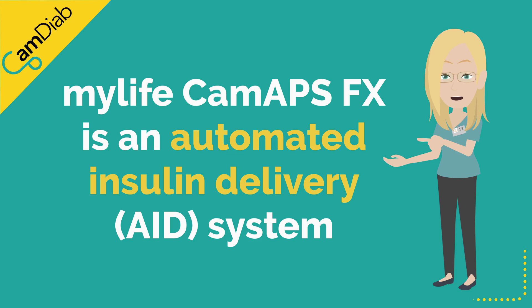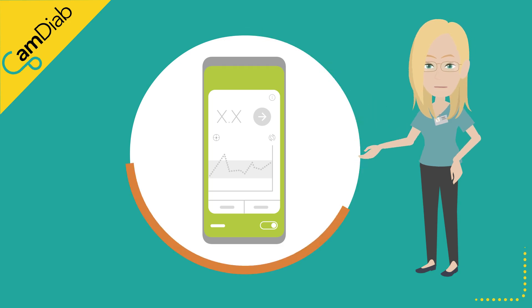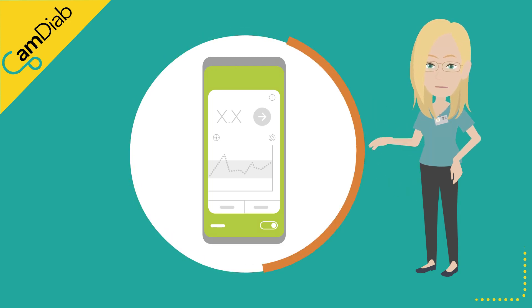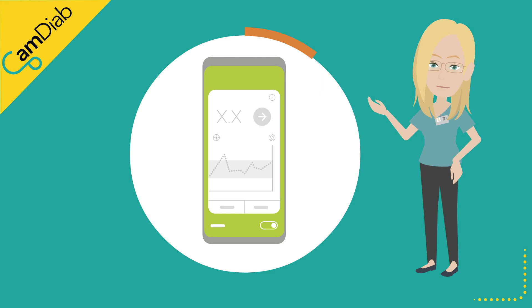MyLifeCam APS-FX is an automated insulin delivery system. This means that it is constantly working to adjust the amount of insulin being given by the MyLife Ipso pump. It uses its learning as well as the current glucose trends to decide how much insulin is needed.